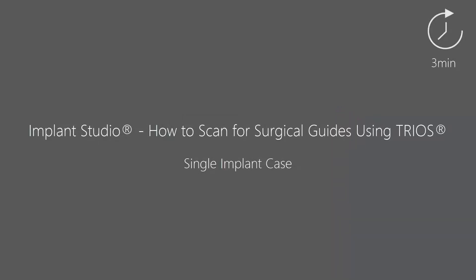Welcome to this How to Scan for Surgical Guide series, where we will explain how to scan for a particular case. In this video, we will show you how to scan a patient with a single implant.